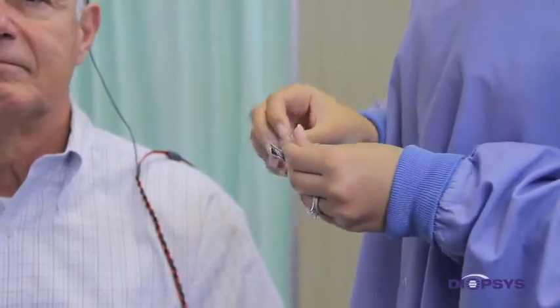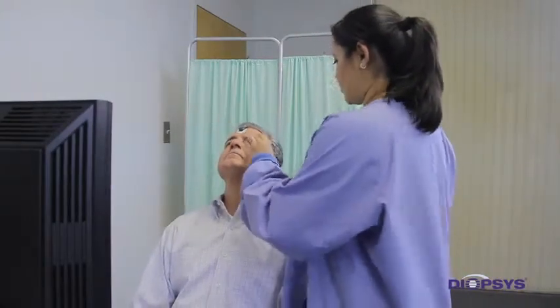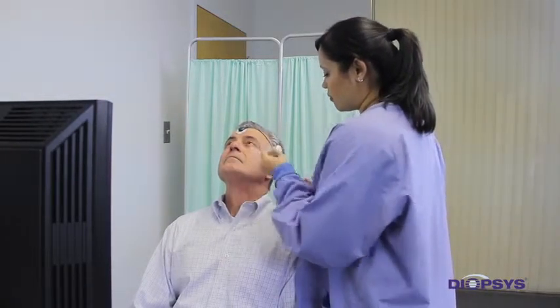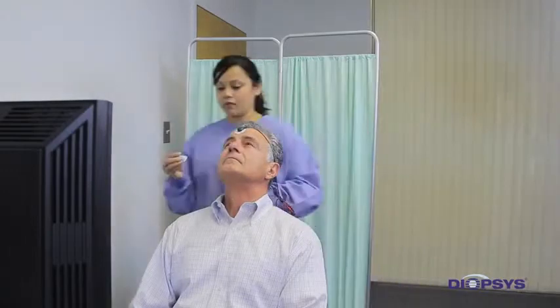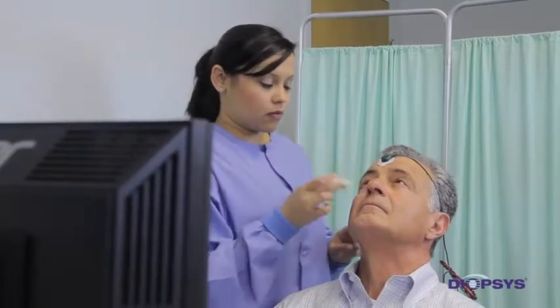Roll a lid scrub pad to create a rounded edge. Ask the patient to tilt their head back to look up at the ceiling. Gently cleanse under the eye area of the left eye close to the lash line, rubbing with the pad for six to eight seconds. Gently but thoroughly dry the area with gauze. Clean under the right eye using the same steps. Then repeat the cleansing and drying process for both eyes' lower lid skin again. It is important to do this cleansing step twice to assure both eye areas are prepared for the lid electrodes.